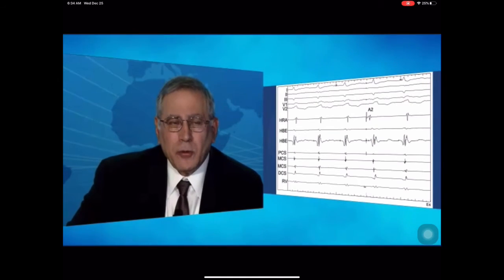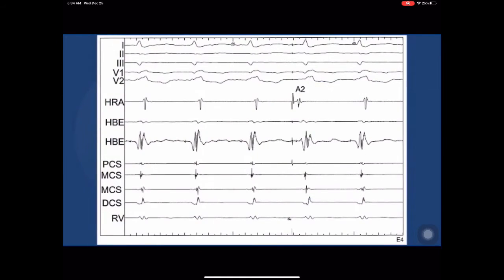So let's move on to the next unknown tracing. In this tracing, you have a tachycardia that's relatively slow. There's a His, and there's retrograde activation, or maybe it's not. It could be just an atrial tach. You don't know. So what you do during tachycardia is you put in a premature atrial complex. The PAC is put in here right on time with the His.